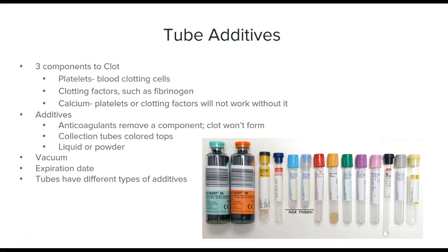Okay, the tube additives. So in this picture are examples of most of the tubes that we use in the lab, and they have different color tops. So the color tops tell us what's in them.